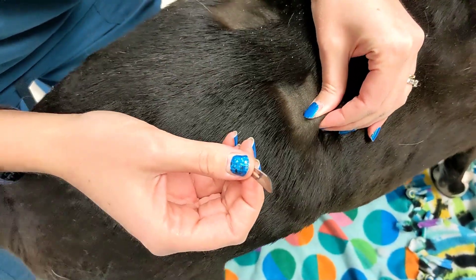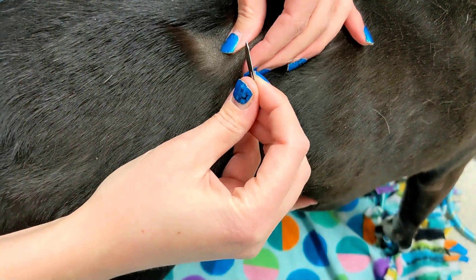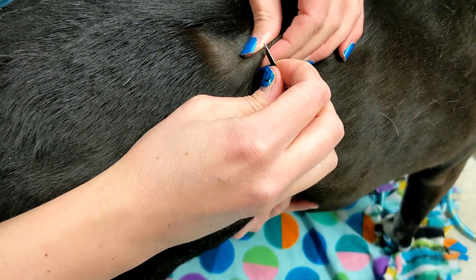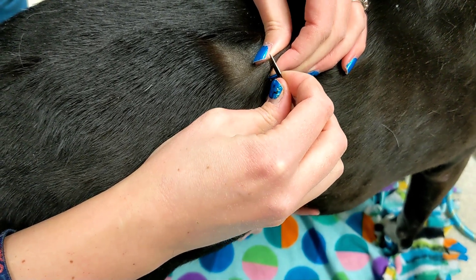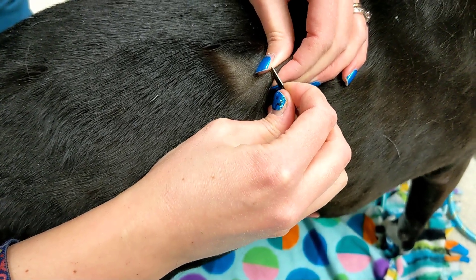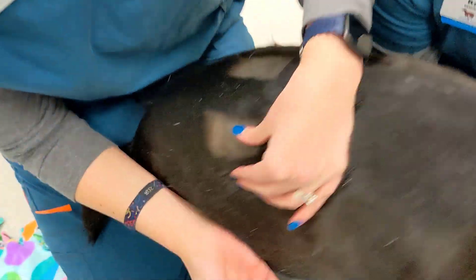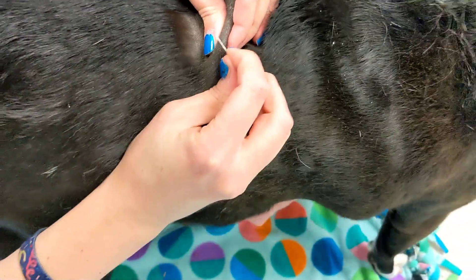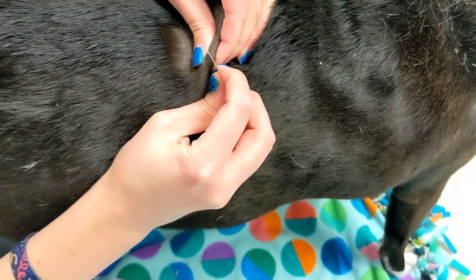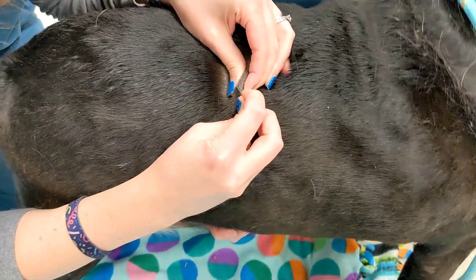We're going to pinch the skin nice and tight. What that does is if he's got any sort of parasites, they're going to come up to the surface. And we're going to scrape — we don't want so much pressure that we slice into the skin, but we want enough that we're getting those skin cells. We're going to scrape until we get what we call capillary blood, which is just a little bit of a blood tinge on the skin.